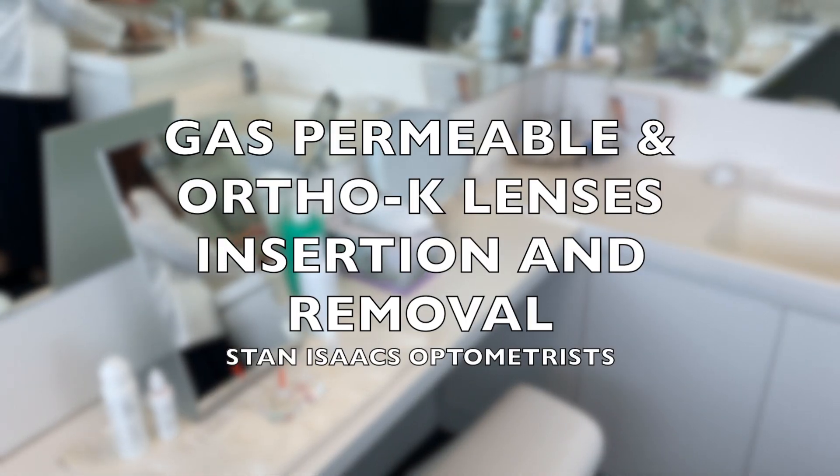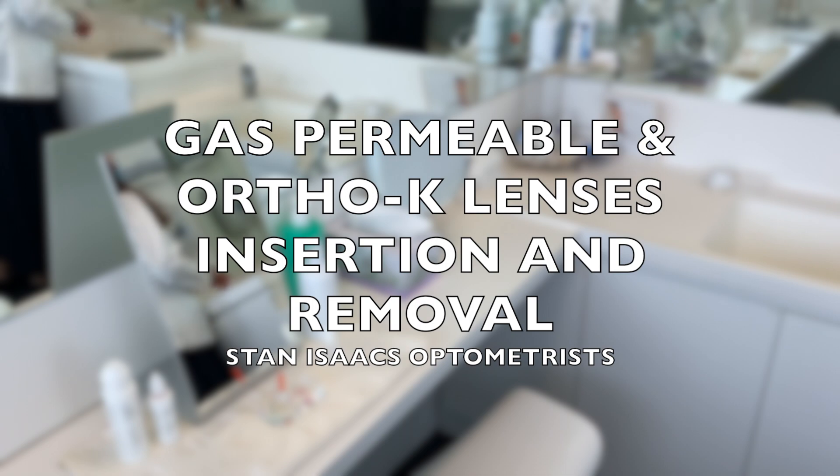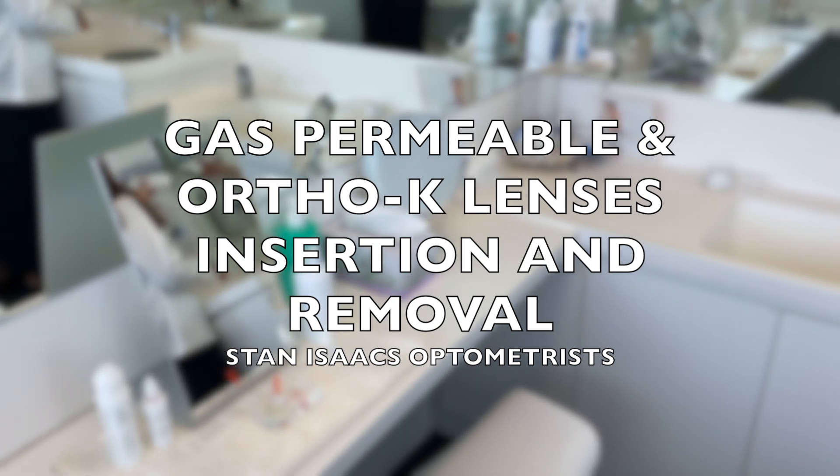Hello my friends! Today, I'll be teaching you the correct method to handle your Ortho-K or gas-permeable contact lenses.